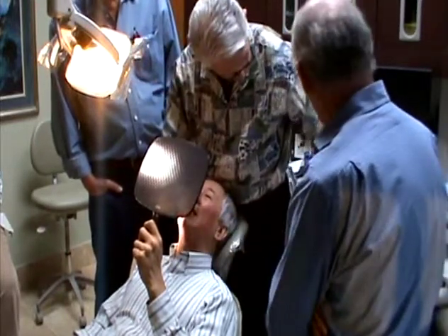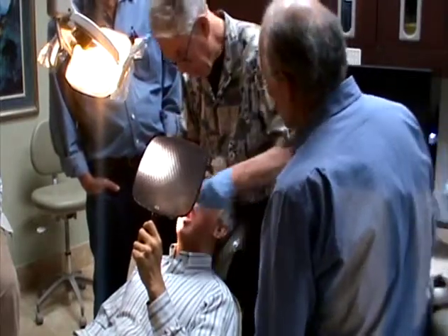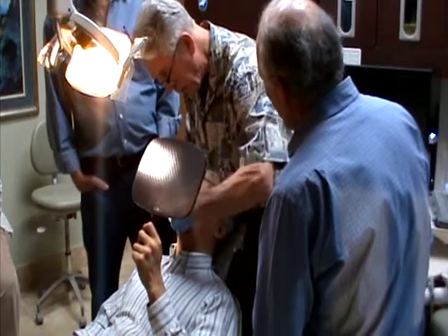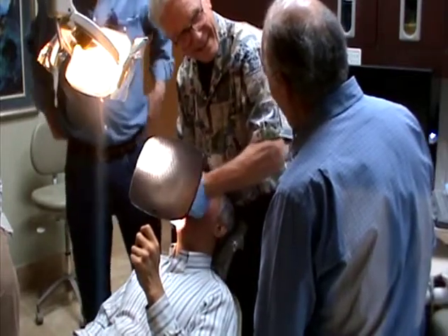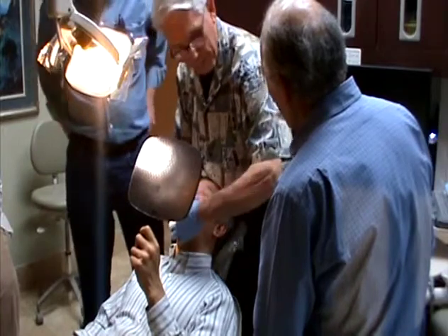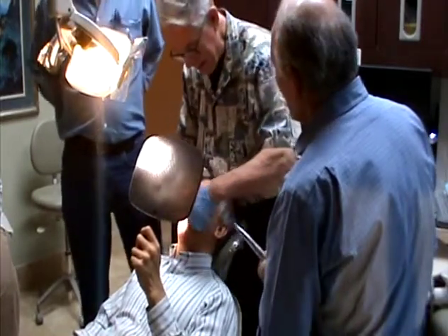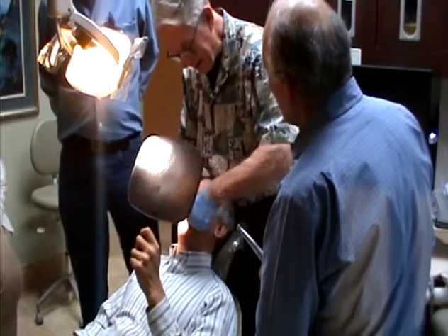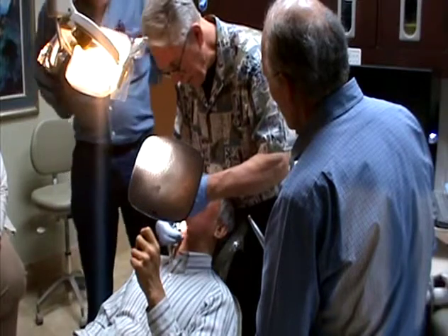Just wipe all that off, just make sure we don't. Much better now. Can you feel it smoother? Yeah. Your muscles are gonna like that. I don't usually do this before I have an appliance in. He's doing what the patient wants, not what he recommends. Happens sometimes. Let me tap you down.